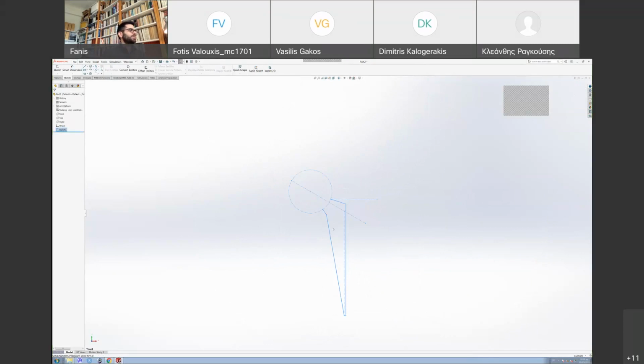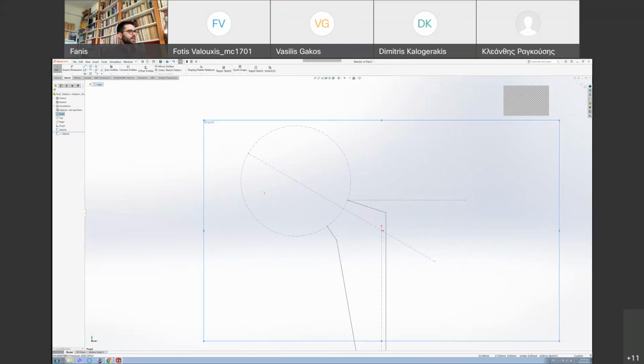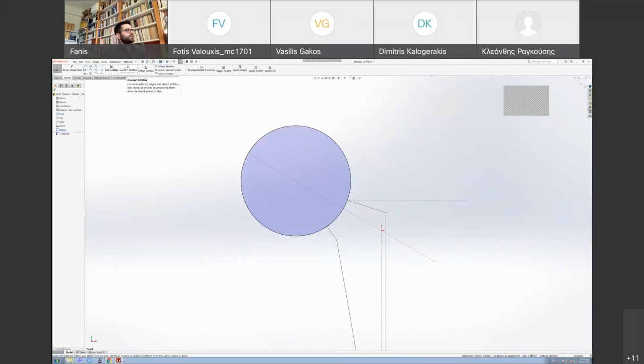The first solid we're gonna create is the sphere. So we go ahead and begin a new sketch. Now I have the sketch visible, but another way to do it is you can choose the circle, for example, and click convert entities if you just want to see it in your sketch. Okay, for now it's not required. So the way to create a sphere, you probably know that, is you just revolve half a circle around itself.